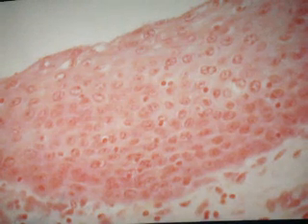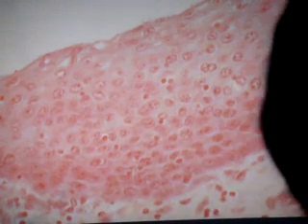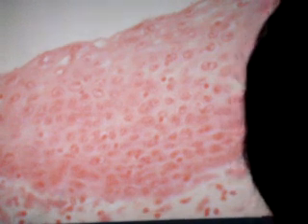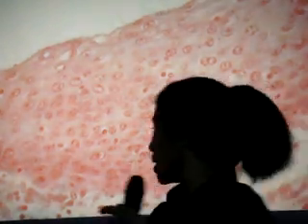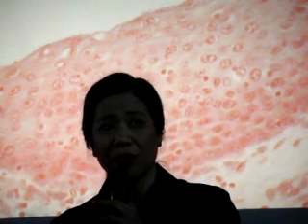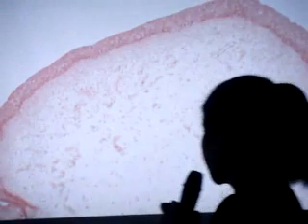So remember, you name the epithelium according to the shape of the cells on the topmost layer. Hindi dun sa lowermost layer ng cells. Kasi most of the time, the cells at the lowermost layer are what? Columnar. Diba? Okay. Stratified squamous epithelium, wet type, or non-keratinizing.